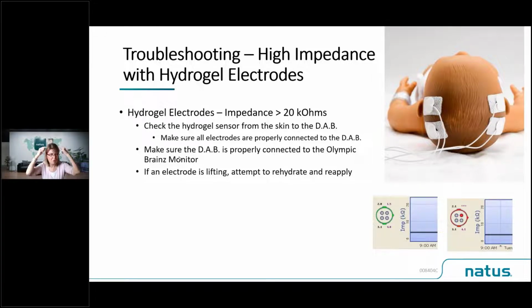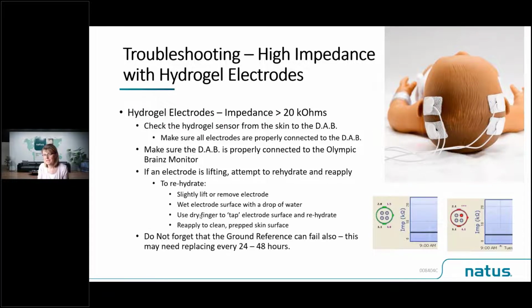So if you've caused this sodium ion channel on the baby's head, you can actually make the aEEG trace appear flat, because all that's happening is the electricity is conducting from one point to another. It looks like there's no activity because it's all being conducted around that sodium ion channel. Okay, so do use water for rehydration.